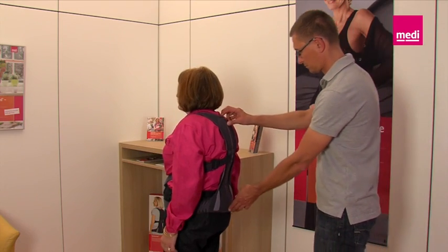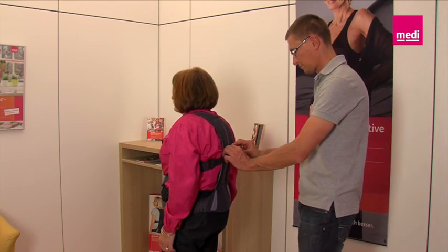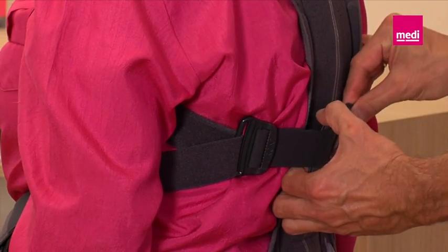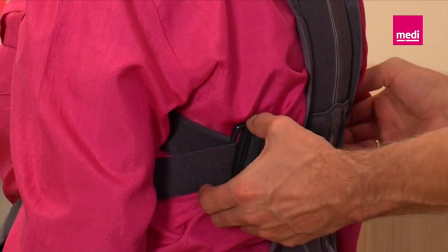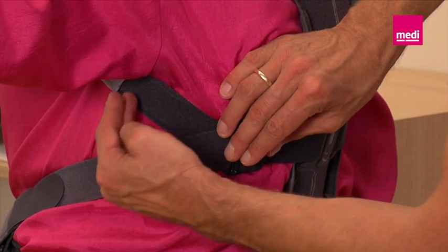Check again that the back rod is correctly positioned. Now you can set the elastic intermediate strap to the right height without any tools. Remove the Velcro fastening of the strap and position it at the level of the lower ribcage. When positioning the strap loop, make sure that it is located behind the armpit — only then can the spinal brace have the necessary traction to straighten the patient.